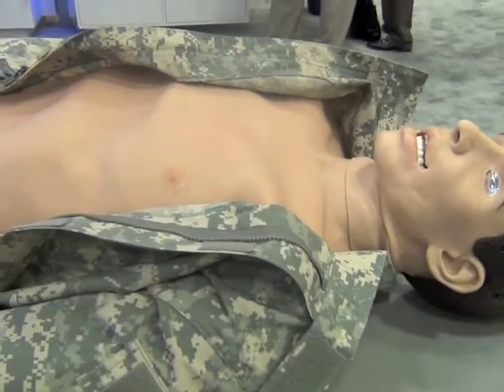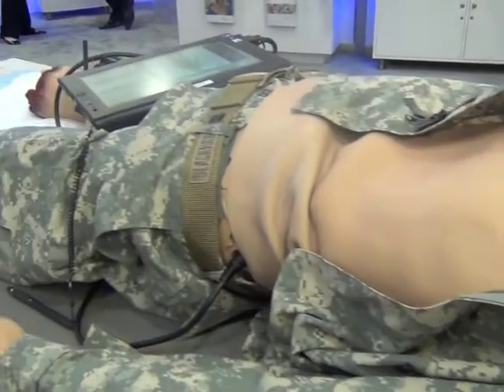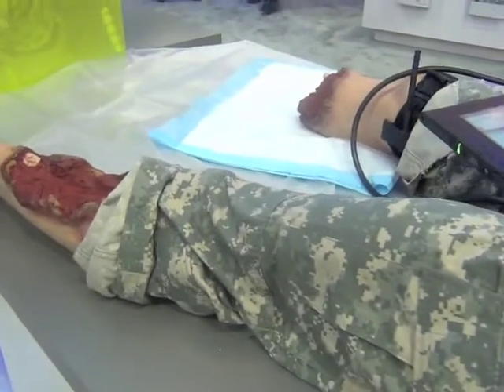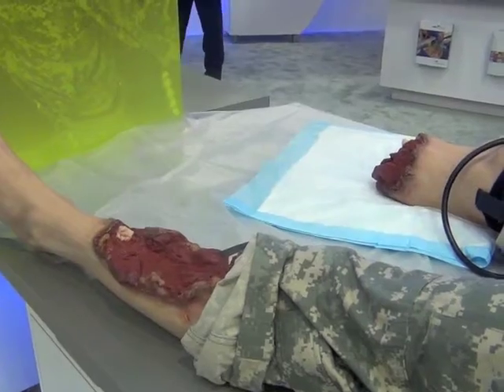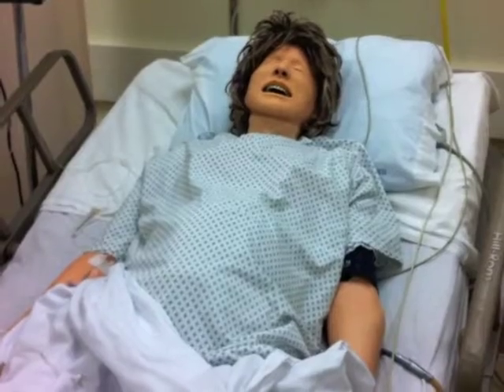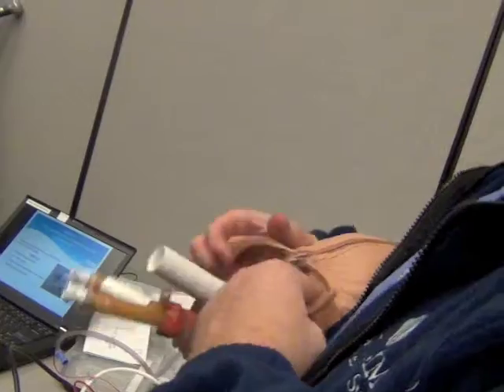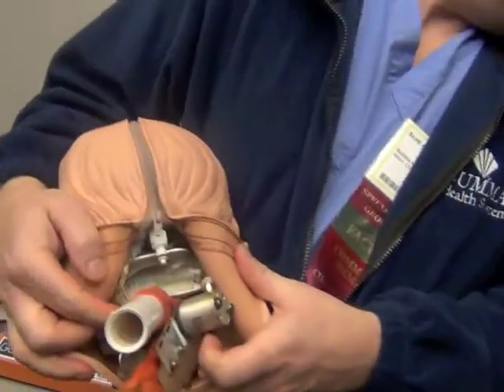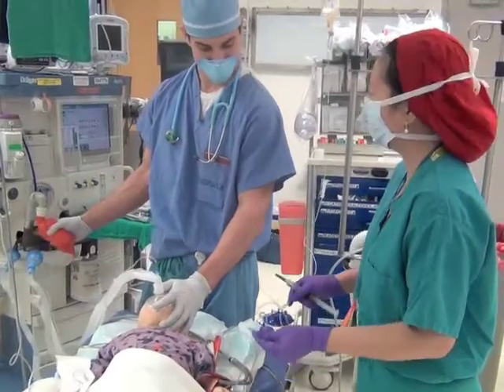Many of the simulators also allow extensive treatment interventions, such as intubation, intravenous and intraosseous cannulation, and even thoracocentesis. Incorporated with a real workplace backdrop, their realistic feedback features provide a high clinical authenticity, facilitating participants' suspension of disbelief.